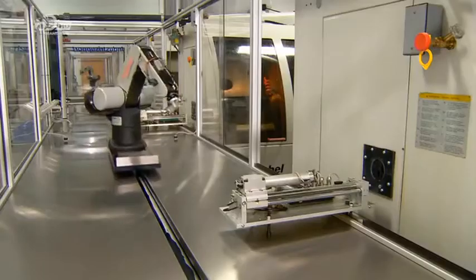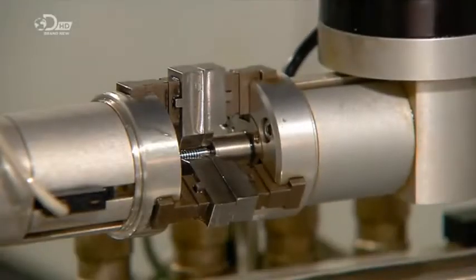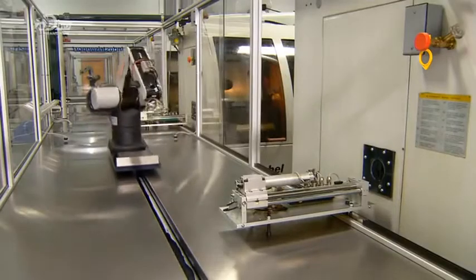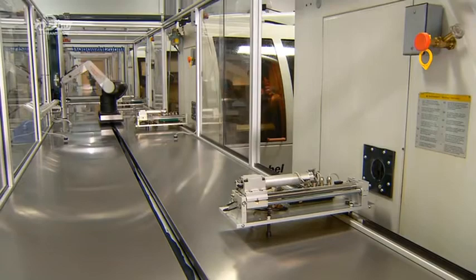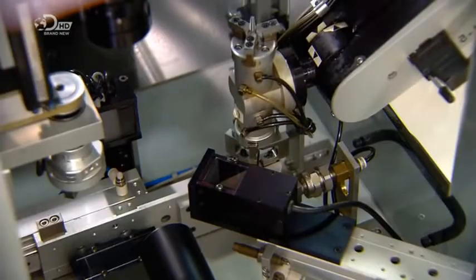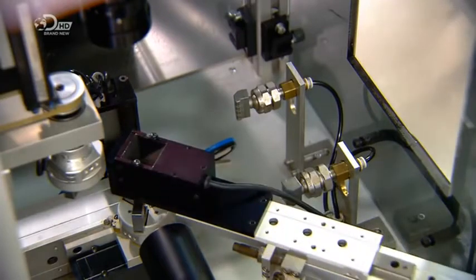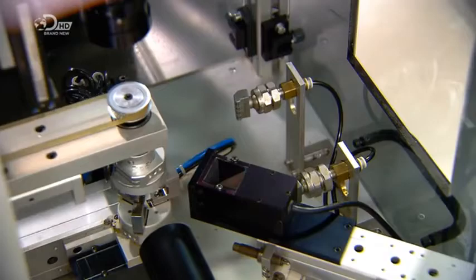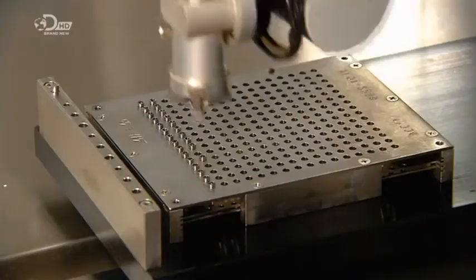A robot now retrieves the implant and transfers it to a cleaning station and then over to what's known as a vision measuring system. Here, a camera takes pictures of the implant from all angles and sends the images to a computer for analysis. The computer confirms the dimensions are exactly right. Then the robot collects the implant and places it in a slot in a tray.